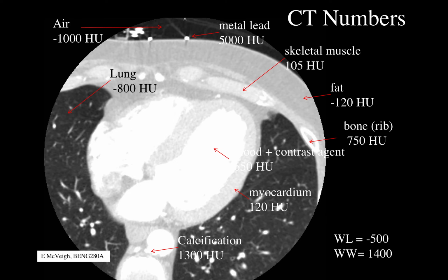Could you tell how much is occluded when you look at the artery? Yes, absolutely. One of the problems with calcium in the coronary arteries is that oftentimes the calcium is quite large compared to the lumen of the artery itself, and the calcium has a very high brightness, high signal.